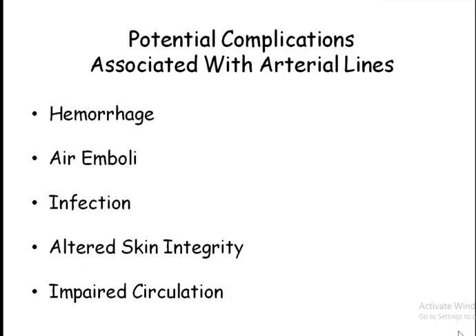Now, what are the potential complications? This is another important slide that you should know. There can be a hemorrhage while inserting, so you should know the coagulation profile of your patient, what the platelets are, whether the patient is in uremia, platelet dysfunction. In all these patients, you should be ready ahead, and you should do the procedure cautiously.